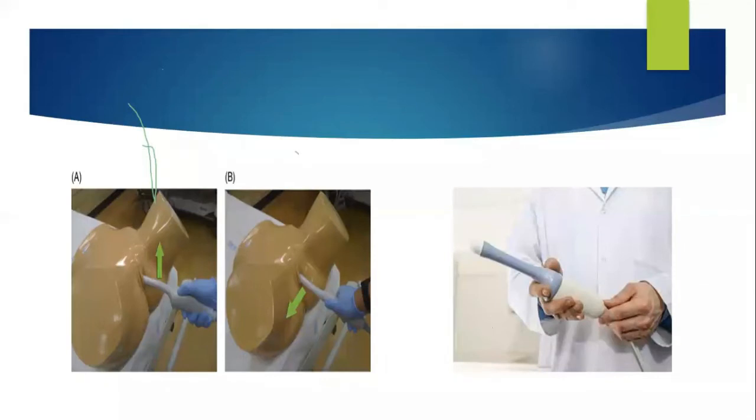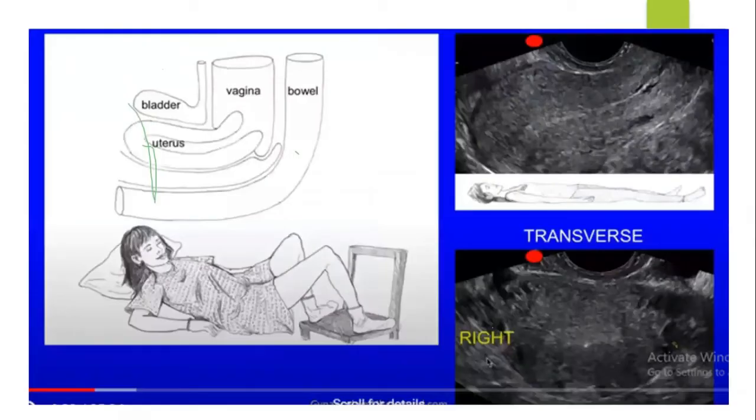So remember this by heart, that whether you're already doing a transvaginal scan or you are a beginner, you must identify the probe marker, put it at the 12 o'clock position, and insert it inside the vagina to look into the mid-sagittal section. And when you want to see the transverse section, rotate the probe anti-clockwise to look into the transverse section of the uterus.